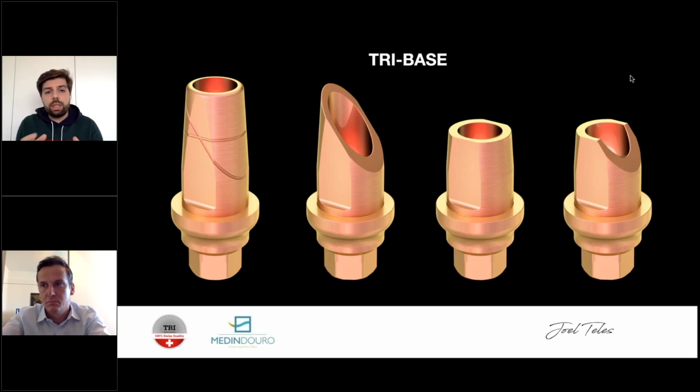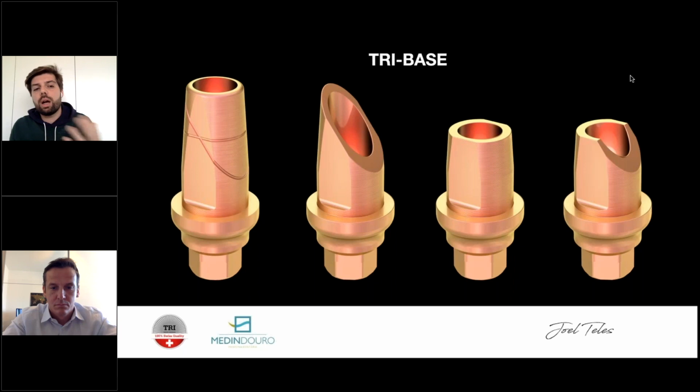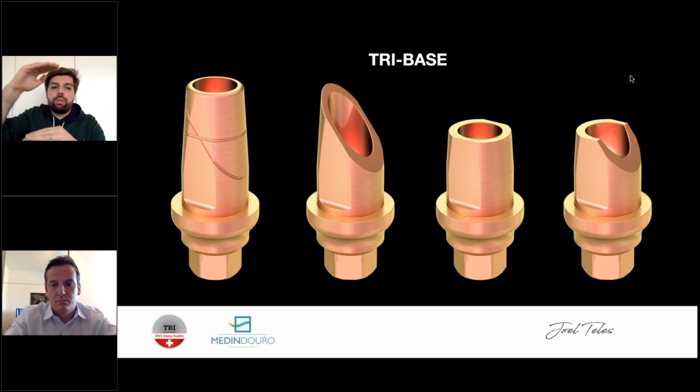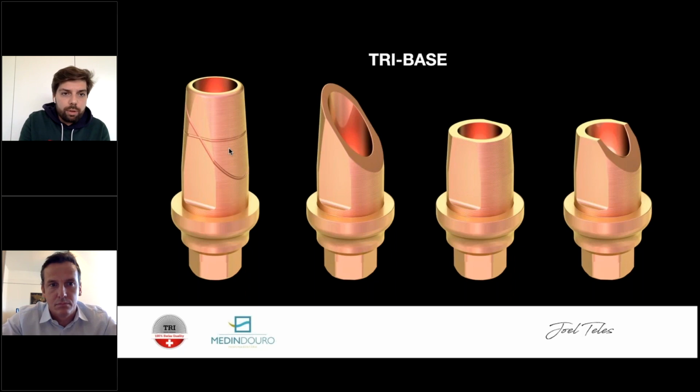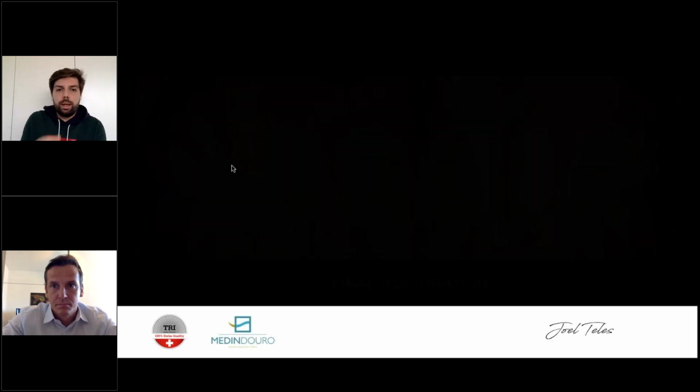So the amount of problems we were having back in the days is now way less, because as you see in the digital world, you get to choose the height of ideal tie bases for that case and the shape, and you can use their tie bases, which by the way have a rough surface, and the cement will hold firmly, and you have really better results using monolithics or zirconium frame cemented, screw retained restorations.